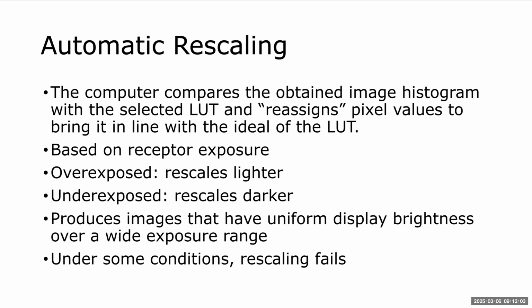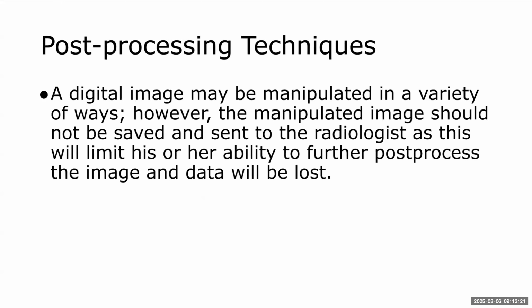Now, sometimes automatic rescaling is going to fail. When you have overexposed the patient to the point of saturation, or you have underexposed the patient and you have photon starvation or quantum mottle, it can't fix those things. So everything has limits, but it does have the ability to fix a lot of exposure mistakes. But we don't want to depend on that. We want to try to use the amount of exposure that's appropriate for that particular patient, size, condition, whatever.